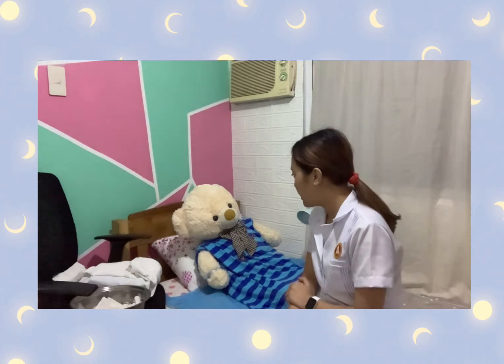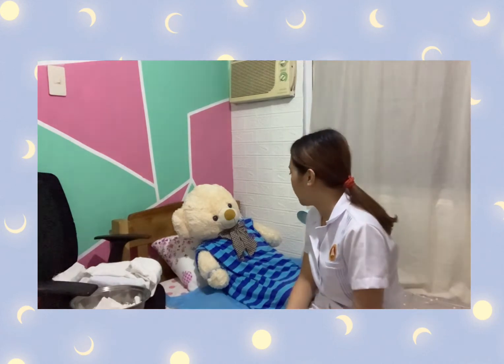Also, ma'am, before we start, may I ask po if you have an iodine allergy? Wala po. How about latex po? Wala naman po. So, that's good po, ma'am. So, we can now proceed po on the procedure. Is that okay with you po?